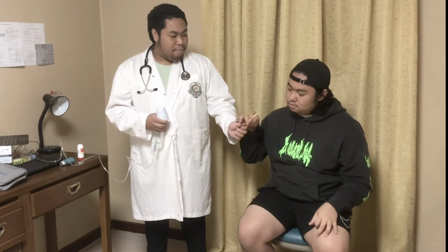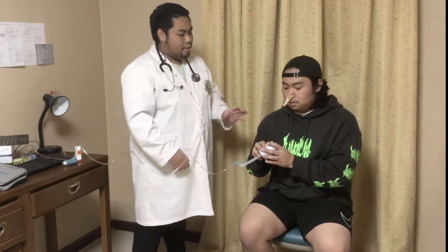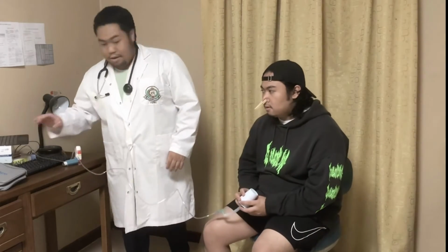Are you ready, sir? Here you go, sir, your nose clip. Make sure that it's in hand. Also make sure that all your stuff is here, your bronchodilators, your emergency kit, and that your spirometer is working properly. So, sir, again, 3 normal tidal breathings, and then as soon as you inhale, you fill up your lungs, exhale with the mouthpiece inside your mouth, and then inhale again with the mouthpiece inside your mouth, okay? Here you go, sir. So, 3 tidal breathings.